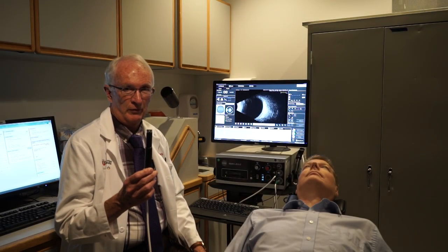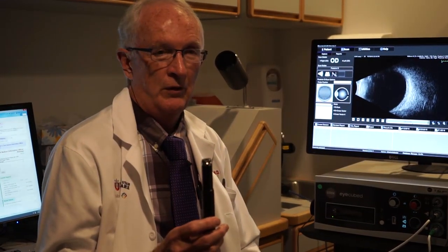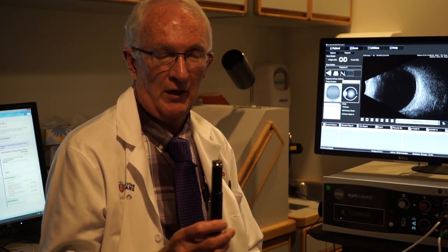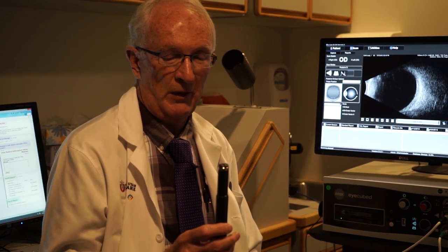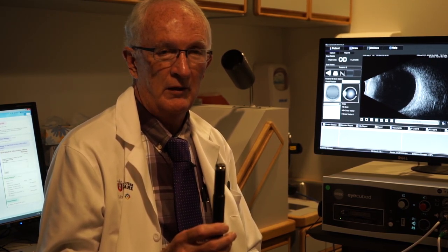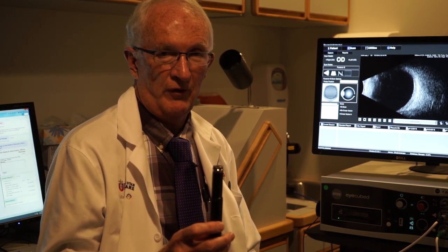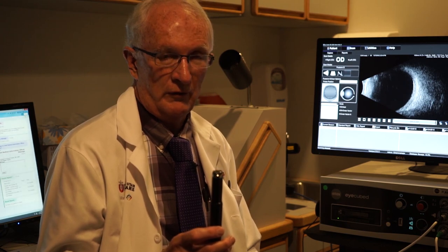This is a standard B-scan probe used in most ophthalmic ultrasound machines. It's a 10 megahertz probe, which is a higher frequency than is used for other parts of the body. We can use high frequency around the eye because the eye is small and full of fluid, so sound penetrates very easily. For the abdomen or other parts of the body, we have to use a lower frequency because penetration is less with high frequencies.